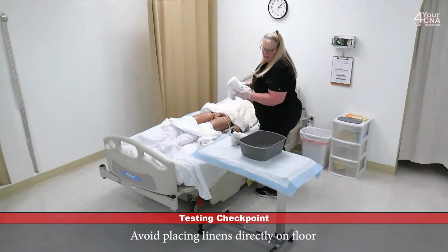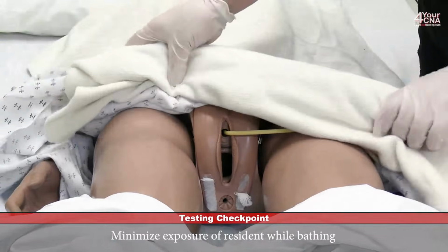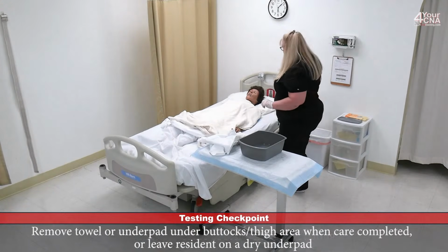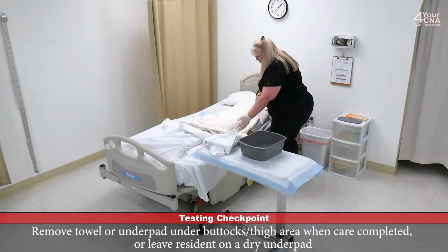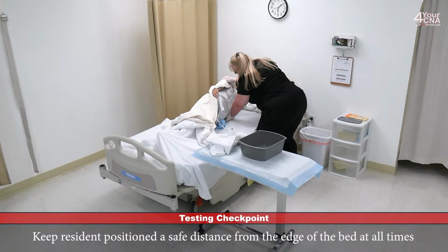We can remove the towel, set it on the table, and we're going to unroll the privacy blanket, trying to be careful not to touch that gown with your soiled gloves, and we'll cover the patient up. Mrs. Jones, can I get you to scoot toward me, and I'm going to remove the pad that's under you. Go ahead and scoot toward me, and on the count of 3, you're going to roll up. 1, 2, 3. I will roll the soiled chucks toward the patient and tuck it underneath her hip.